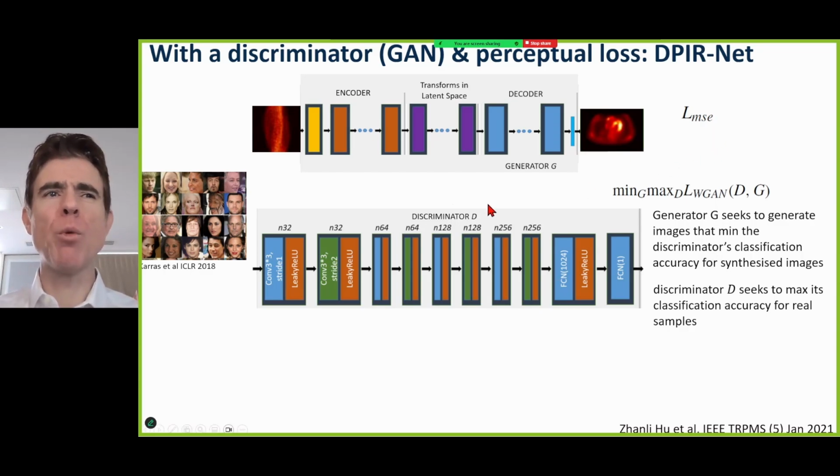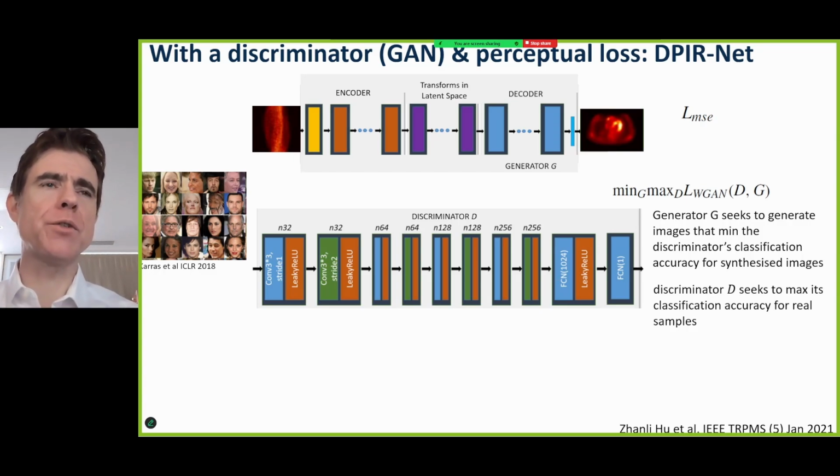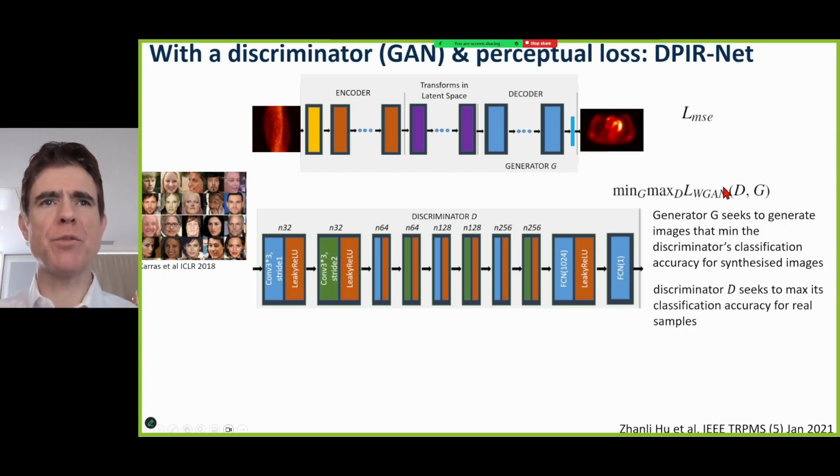training set. I won't go into this in any great detail because we're finding GANs are really beginning to get out of fashion now. They're very finicky with their training. And as I'll be presenting much later on today, diffusion-based methods, generative AI-based methods are now really taking off.